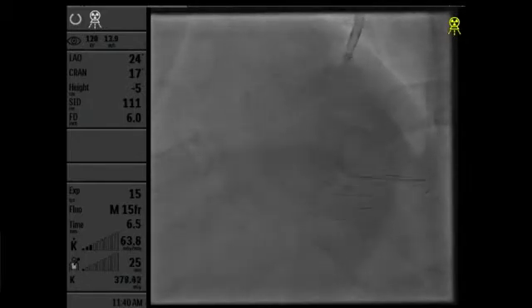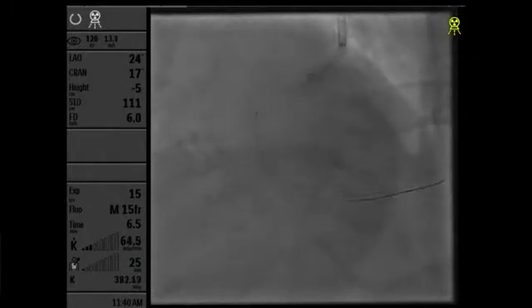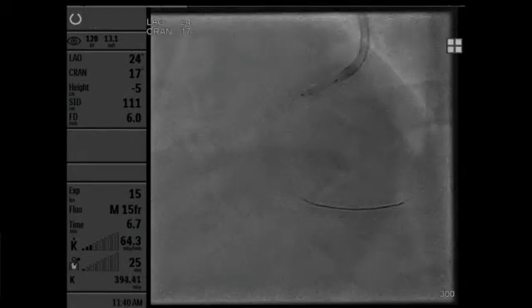Well, it's still struggling there, not that easy. And that's a non-compliant balloon, I assume. Yes, sir. I think you've got an edge on the proximal stent. That's why I would just put a wiggle wire, the smoothest and the best. Or we can get a compliant balloon and it'll just go right by. Exactly. Yeah, that's what I would do.